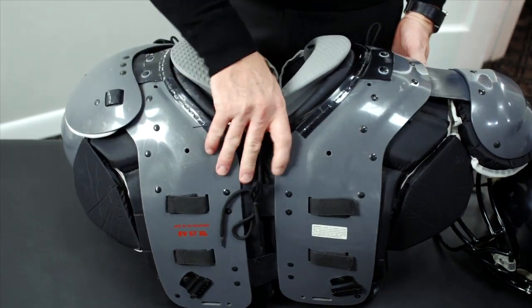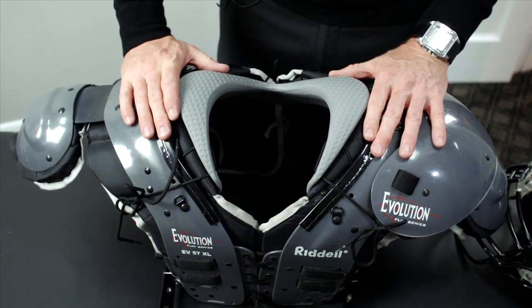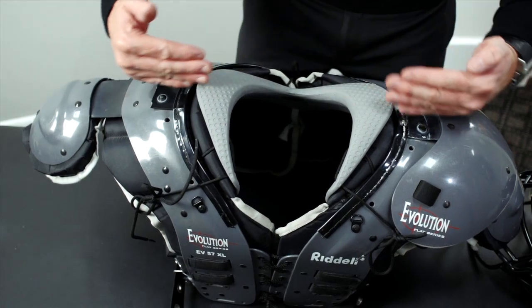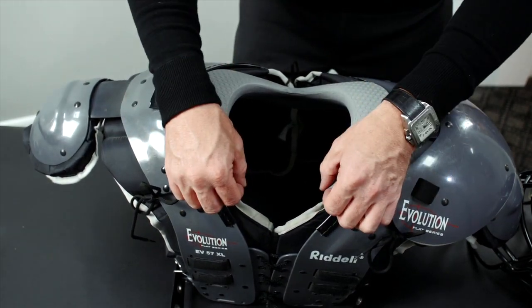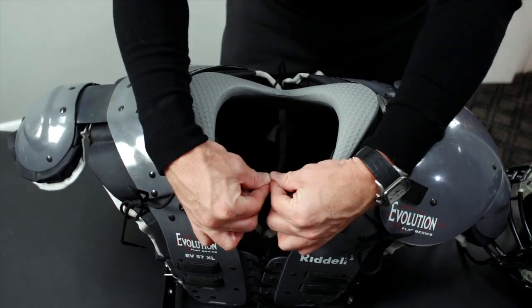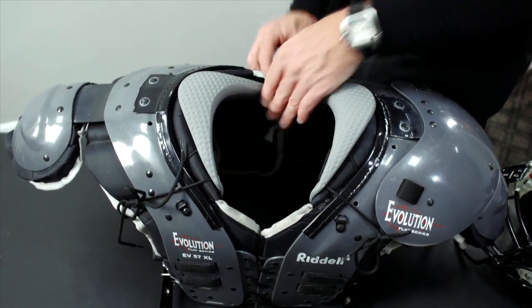And what you're going to notice is that when the Kerr collar is in the perfect position, the compressive element should be right on the sides in the center. The opening of the Kerr collar should be in the front here, open. It is not to be tight. The back is held in place.